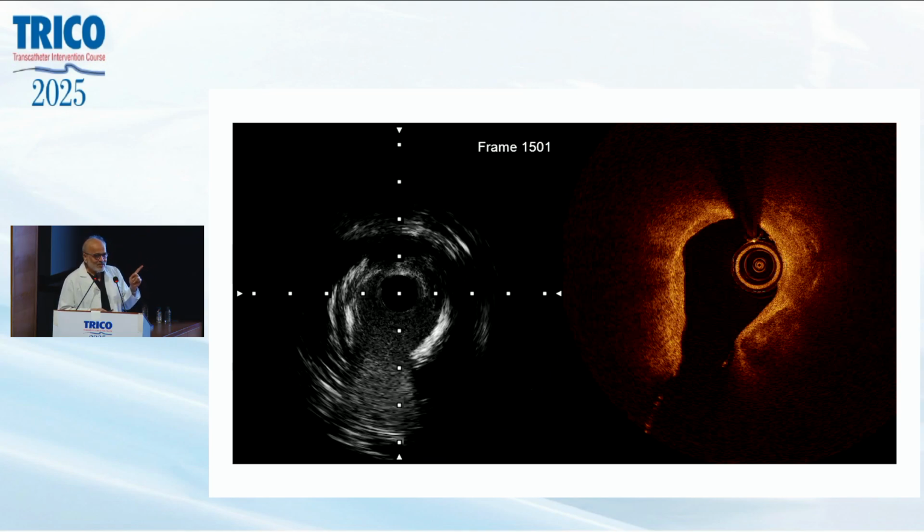Because if this carinal calcium breaks and if the plaque shift happens, there is no way you can give a good lumen in the side branch and you can create a problem. I would like to know from you guys, because there are so many gray areas and we don't know.